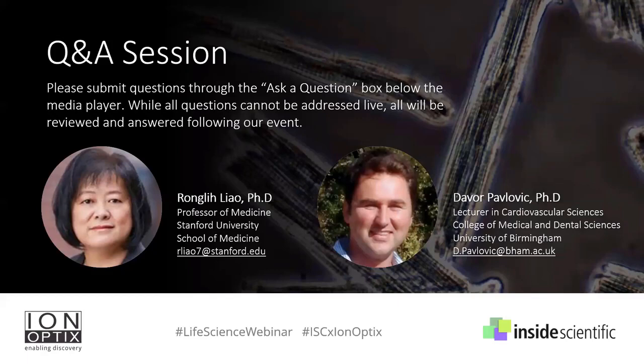Perfect. And now, Rongli, what's your experience with best practices for culturing, or what culture works the best for you? I think, what Davor just mentioned, the field is using pretty much a very similar kind of cocktail with some maybe personalized for a different experiment set. So on those cultures, we're using DMEM, we're using M199. Again, it depends on what experiments you want to do.